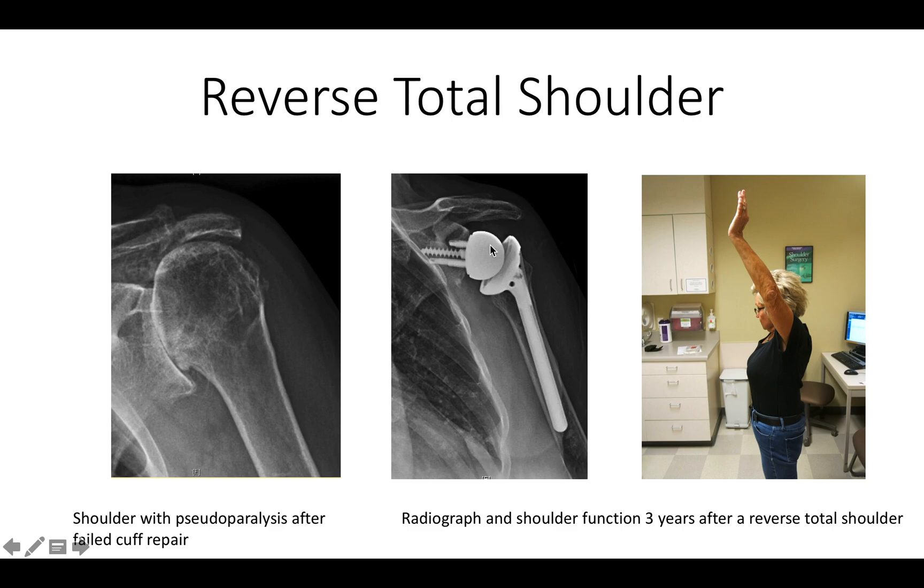Here is a radiograph taken three years after surgery, showing a stable glenosphere, stable base plate, and stable impaction-grafted humeral component. We note that even though her cortex was very thin, we have protection with impaction grafting all along the stem.